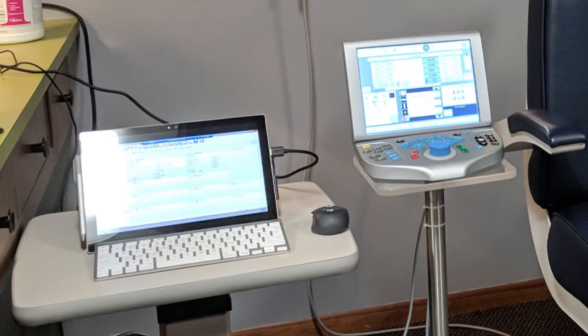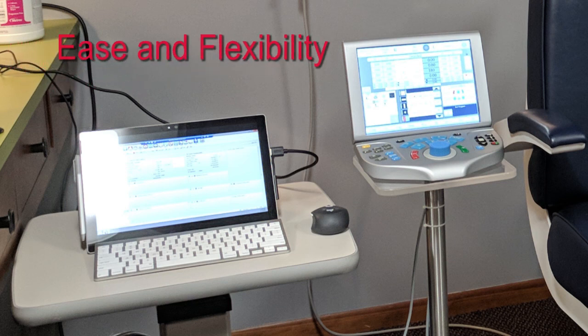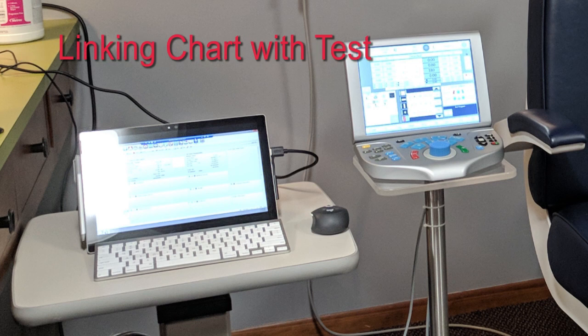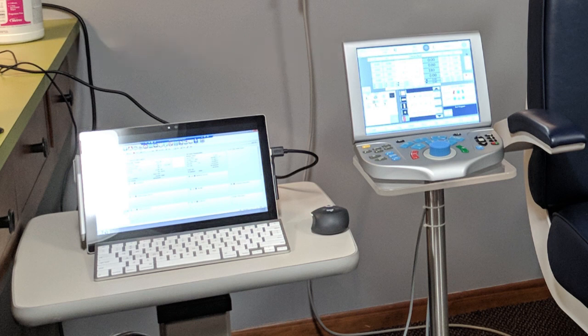I hope the video has given you an idea of how the VRX can help in increasing productivity by chart assignments and how that assignment relates to programming your exam sequence.